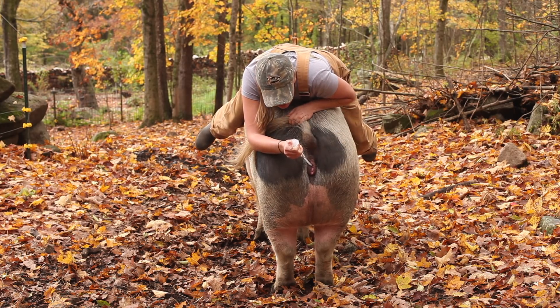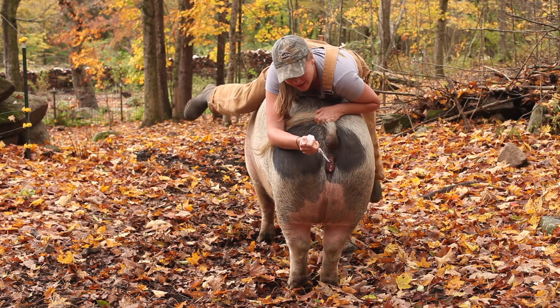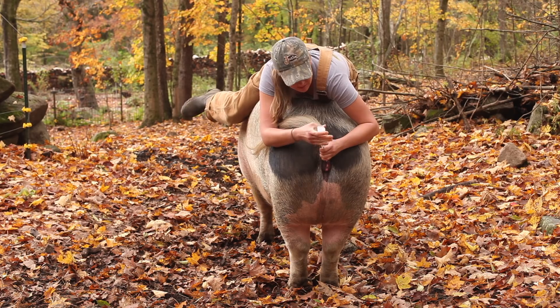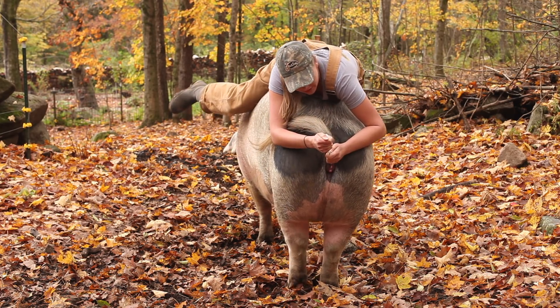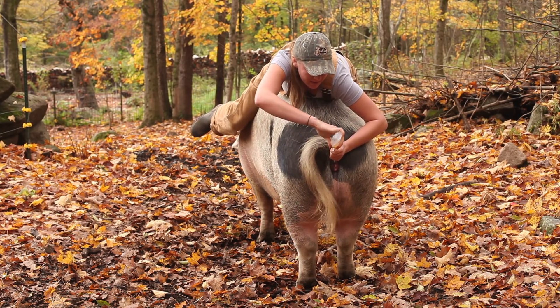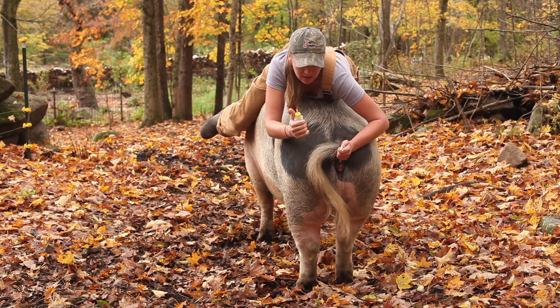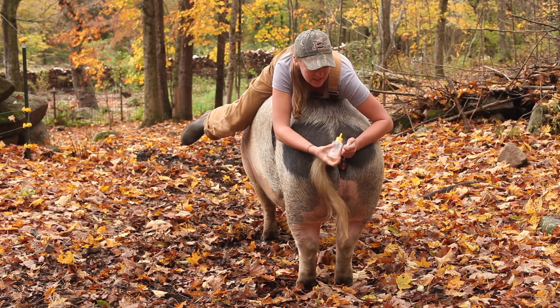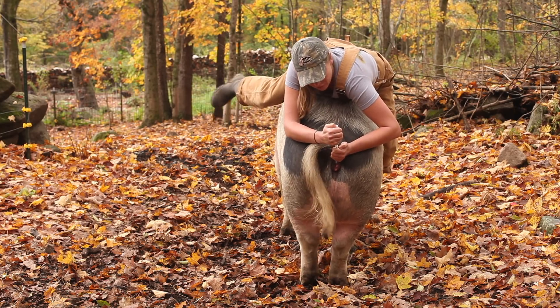You can see she's not losing any out the back — she's taking it all in, which is great. No waste. I'm in the right spot. If you get to the point with your bottle where you can't really squeeze it anymore but there's still some in there, take it off, give it a reverse suck so it pulls in air, and then you can reapply and repeat.